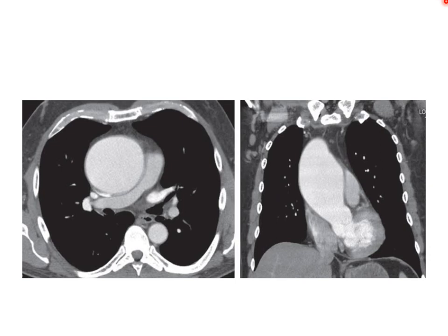By image, you can't differentiate between non-infectious and infectious. No, we cannot differentiate just by image, but combining image, clinical history, lab tests, presentation, and maybe multimodality imaging, for example if you have CT, MRI, conventional angio of course. All of this can help guide us. Sometimes there are some specific features that might help.